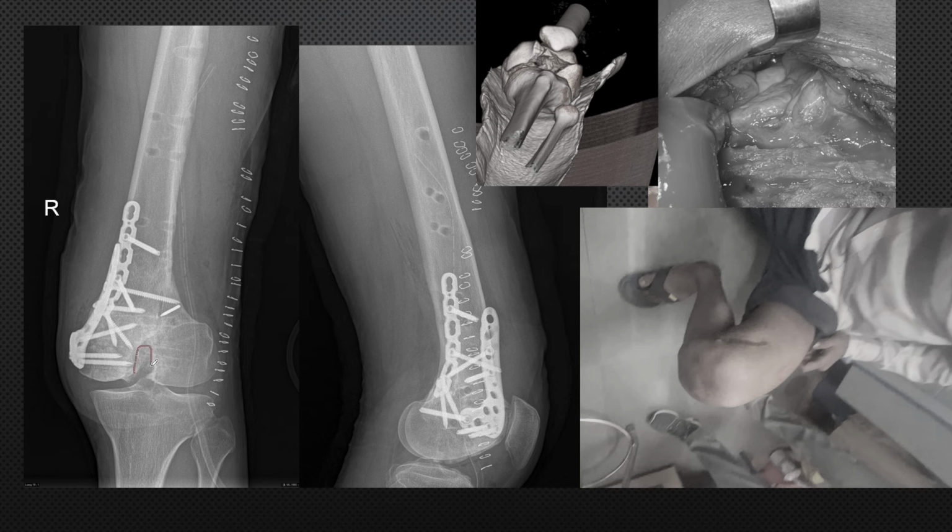And we were concerned about the comminution in this zone from the starting, and we wanted to see what happened to this void. And when we checked intraoperatively, we found that it had been filled with smooth cartilage. You see this part has been filled with smooth cartilage. So probably some kind of fibrocartilage has formed in this zone, and that void is appearing only on the x-ray, and physically it is not there.